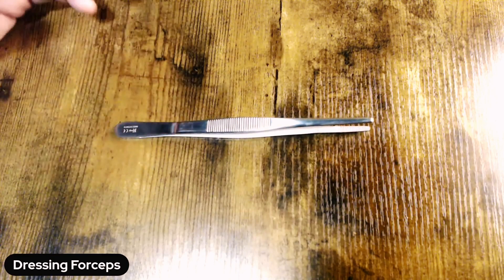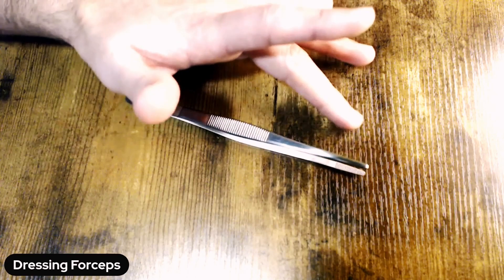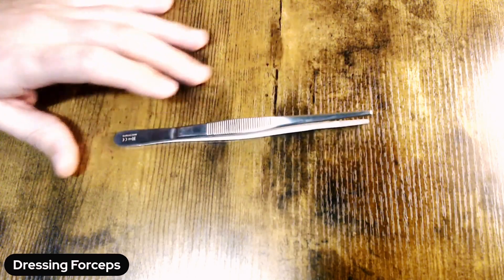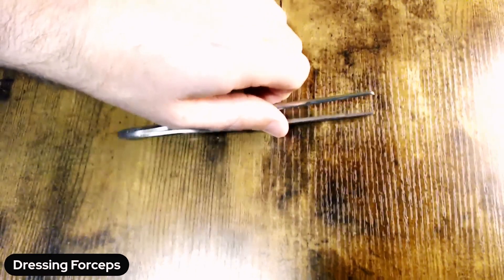As with our other forceps, in terms of inspection, you're going to want to be looking for any debris that's retained in the tip itself or anything that's on the back of the handle towards the proximal end.